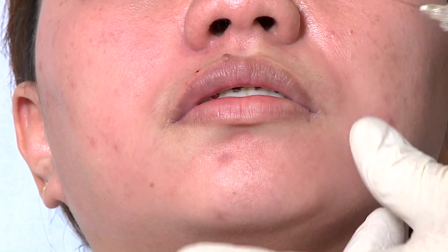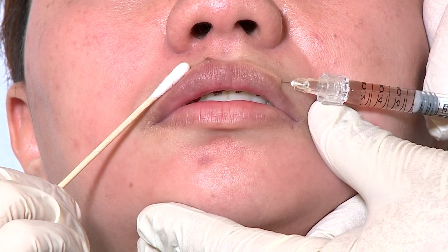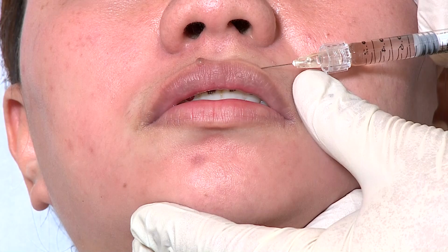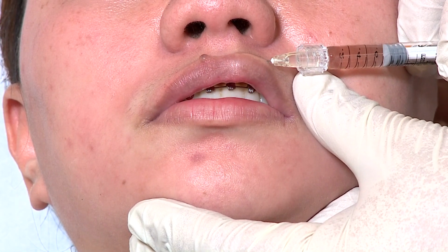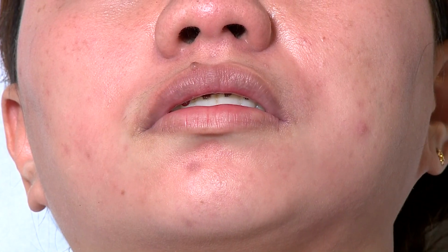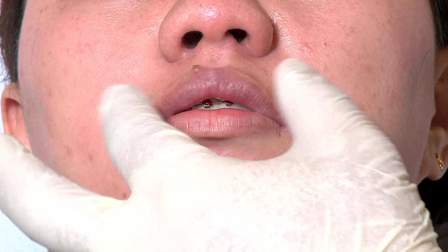The same thing we do on the other side, 0.05 and another 0.05 in the upper part. We use only 0.2 so far for the upper lip, and you don't want much more than that, because you always want the lower lip to be a little bit bigger than the upper lip.